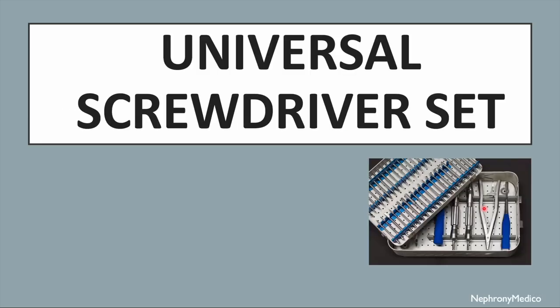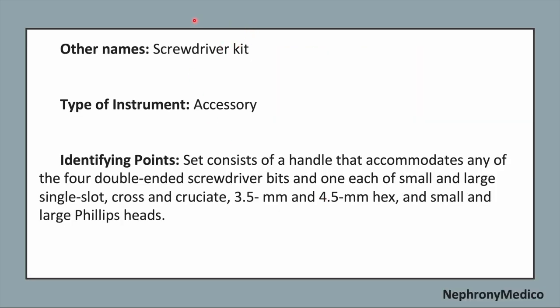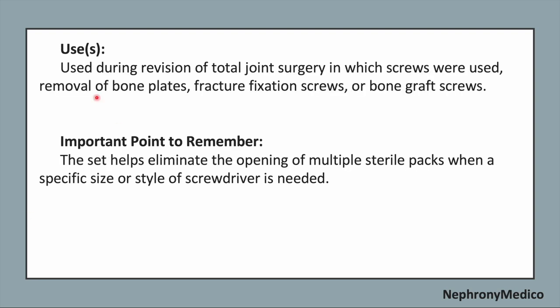Let's talk about universal screwdriver set. This is a picture showing a box or set which is a universal screwdriver. The other name is screwdriver kit, and it is an accessory type of instrument. Now, identifying points. The set consists of a handle that accommodates any of the four double-ended screwdriver bits, and one each of a small and large single slot, cruciate, 3.5 mm and 4.5 mm hex, and a small and large Phillips head.